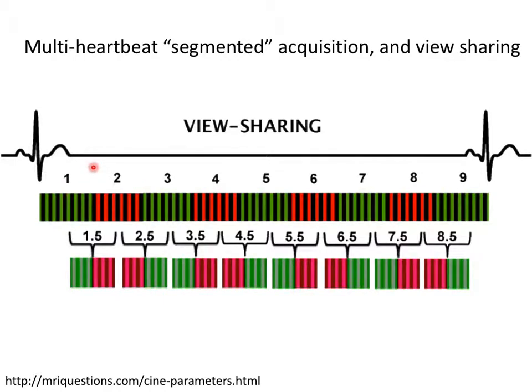The other thing you can do is, if we take some raw data here and raw data here, I can re-bin all of this raw data such that I temporally use the data from this window and this window together to make a third window. And it centers up the time window. It's still the same width.